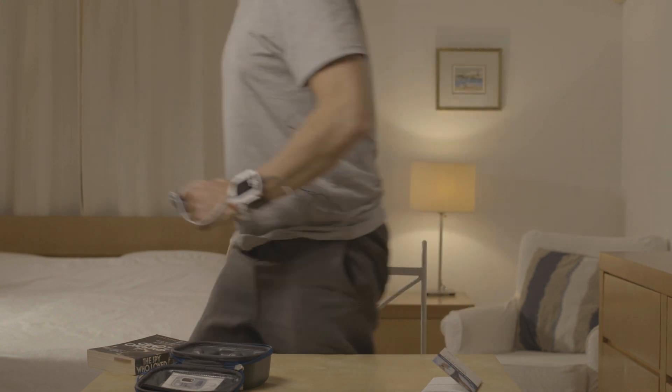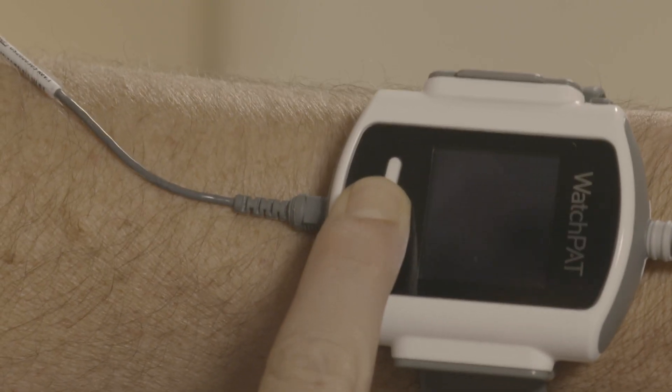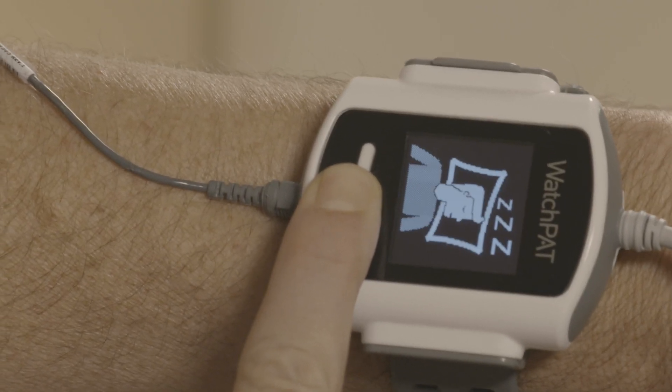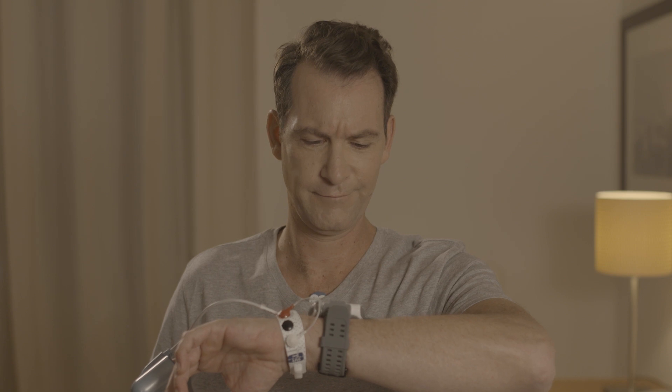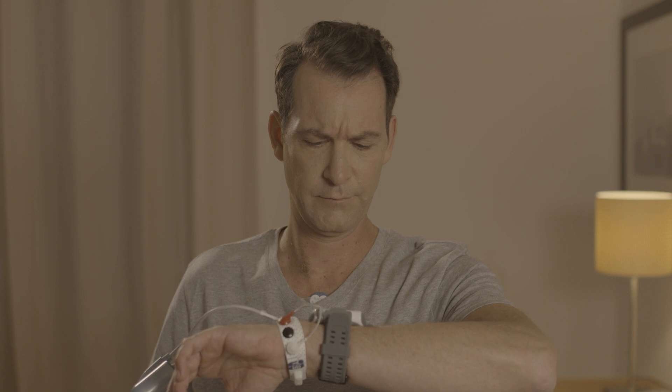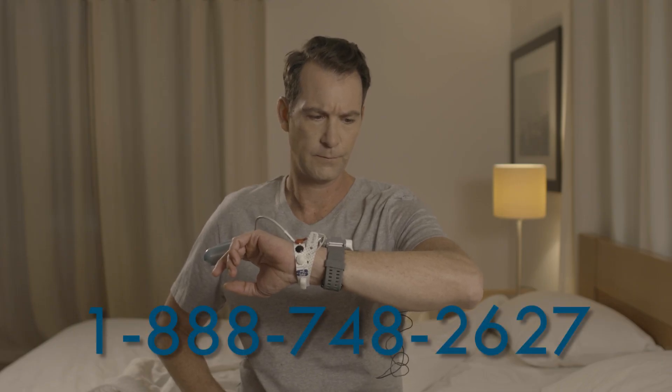You are now ready to turn the WatchPad on. Get into bed. Press firmly on the power button until the display lights up. After a few seconds, the good night message will appear. The display will turn off after a short period. If there is a problem, you will see a test-aborted message. In that case, note the error code and call the help desk.